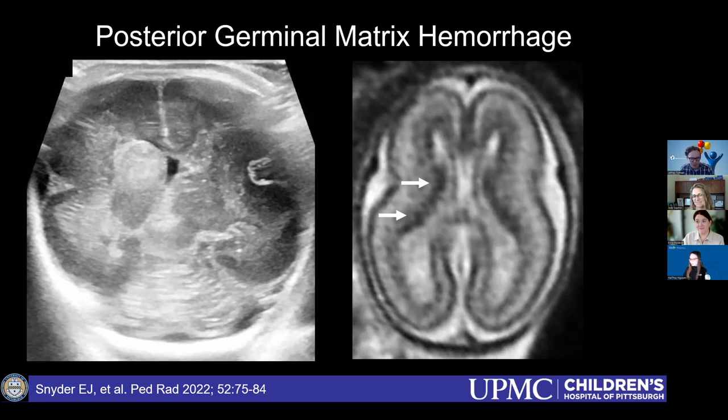The particular area I've struggled with is grade 3s, because some of the conversations I've had with our NICU is that my understanding of the grading scheme is that if you have a bleed and then develop post-hemorrhagic hydrocephalus, does that really count as a grade 3? I don't think so. We have the initial one where they have maybe a grade 2 and then they develop some degree of obstruction from the blood and get some ventricular dilation on follow-up.